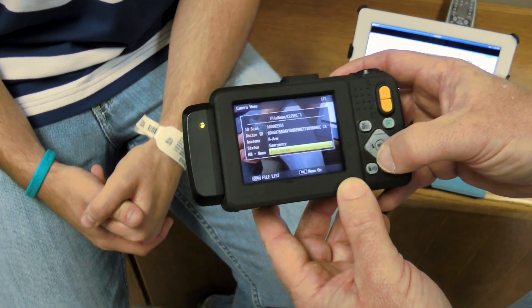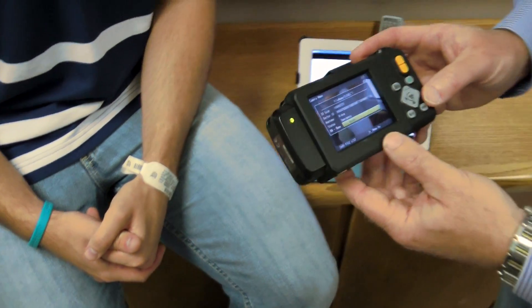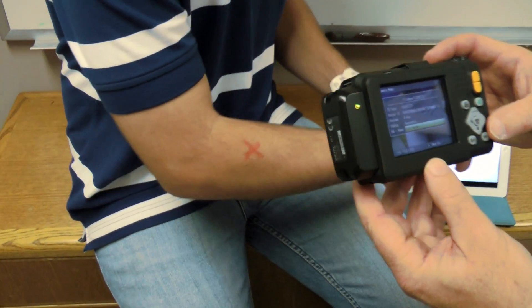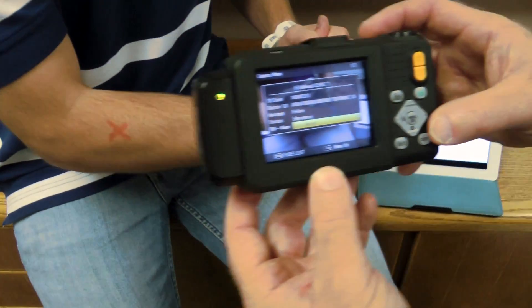And then what do we do here? So you've got all this information — we just take the picture? Just take the picture. Point, shoot.